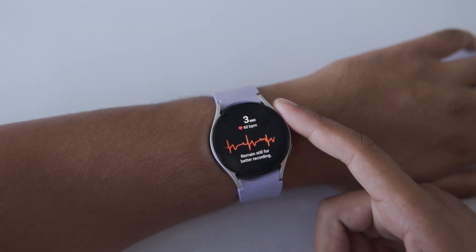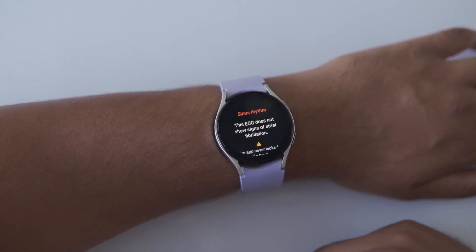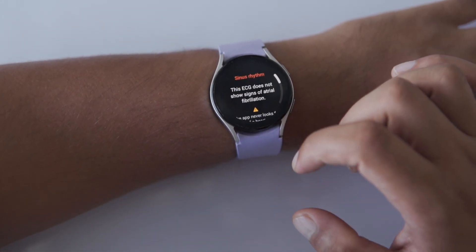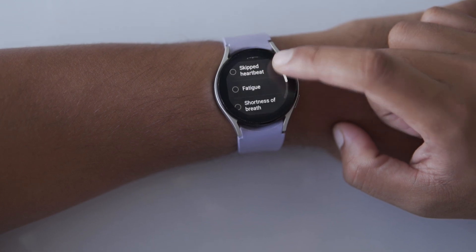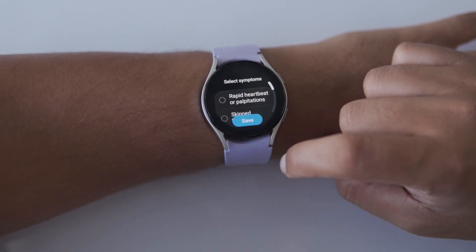Once the 30 seconds are up, your ECG results will show up right on your watch. You can swipe up and down to check all the details. If you're feeling any symptoms like dizziness or shortness of breath, there's an option to add that as well. Just swipe to the bottom and tap Add. You'll see a list of symptoms — scroll through, select whatever you're experiencing and then tap Save.